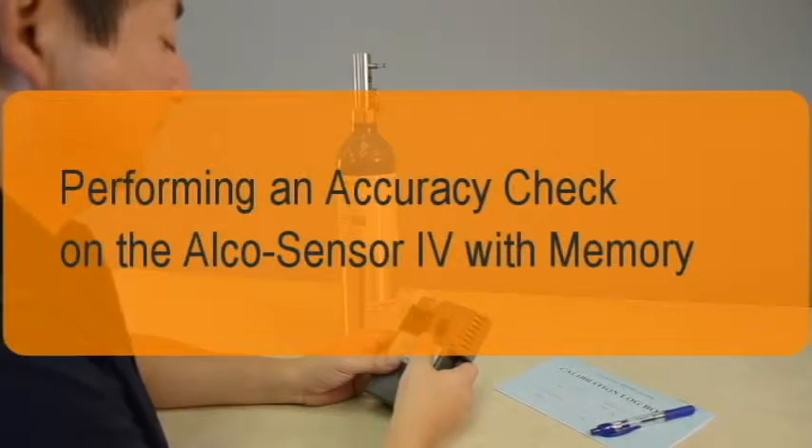This brief video describes the steps for performing an accuracy check on the Alkosensor 4 with Memory breath alcohol instrument using a dry gas standard.